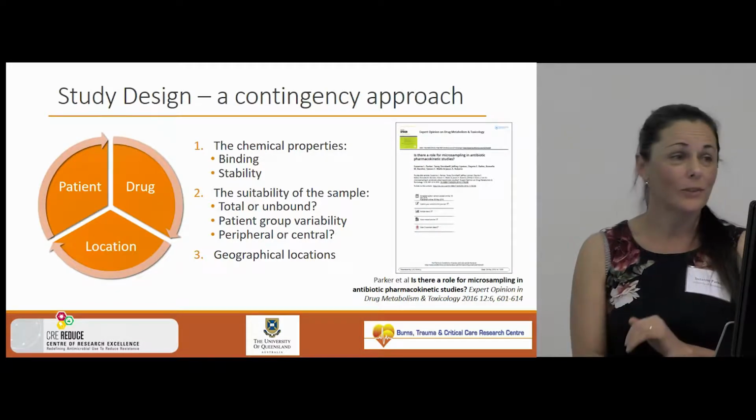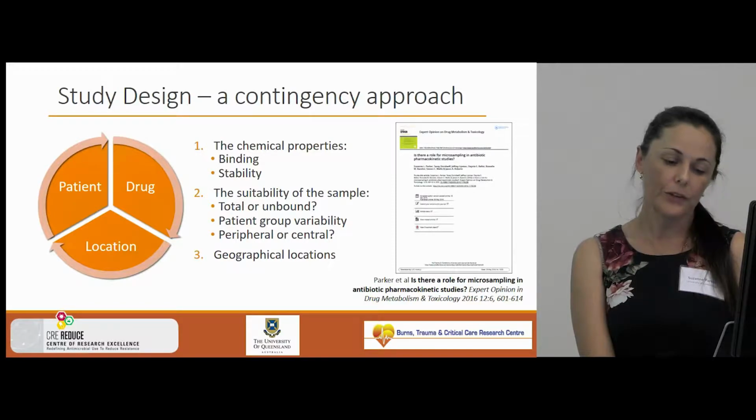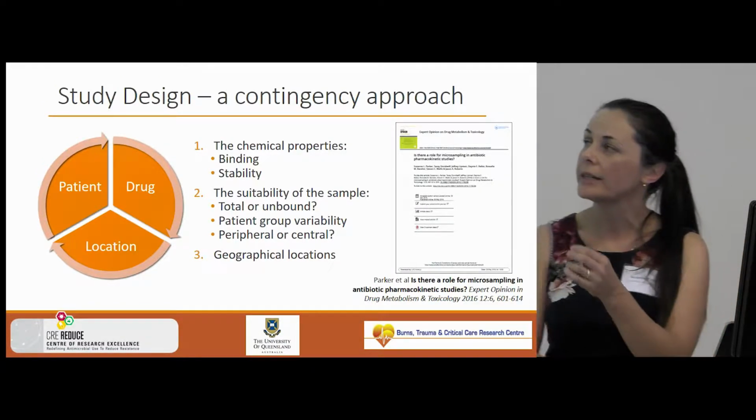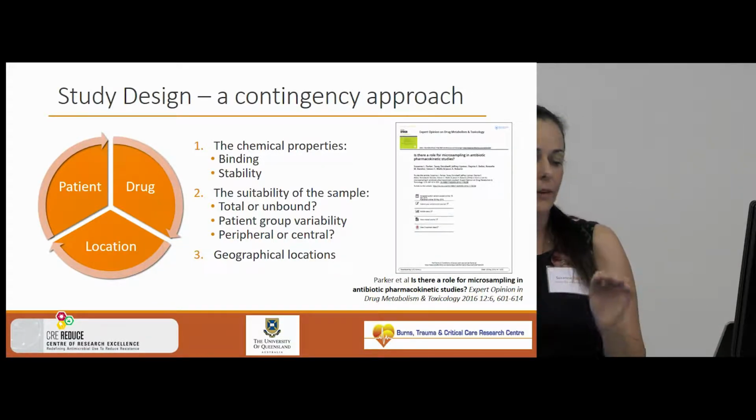I will discuss this a little bit further. The next question then is, will the site of sampling affect our result? We need to know, if we peripherally sample, will we be able to compare this to our central result? This we correlate in our clinical bridging study. We also have to consider the location of our sample, and our patient is remote from our analysis.